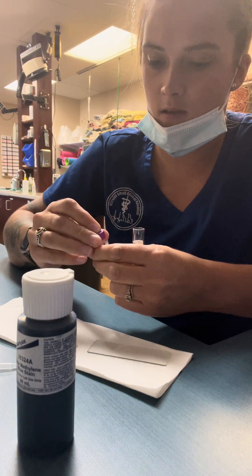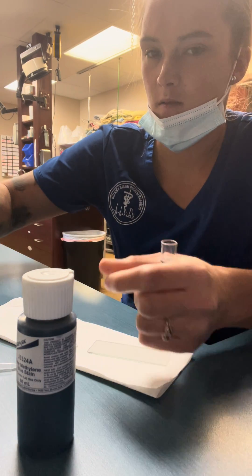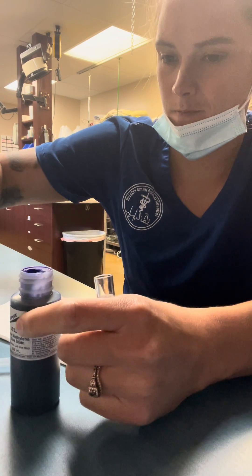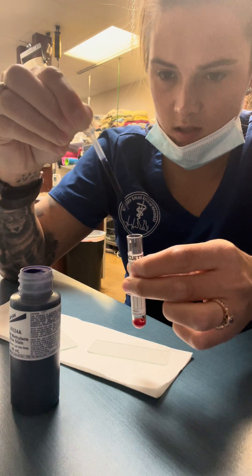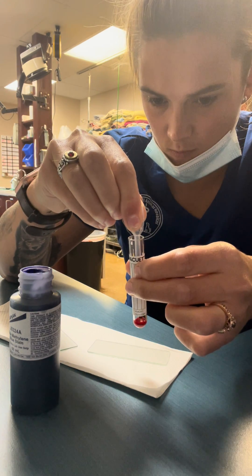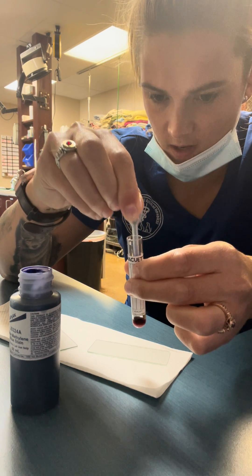And then five drops of my new methylene blue. Same thing, I can go all the way down to the bottom. One, two, three, four, five.